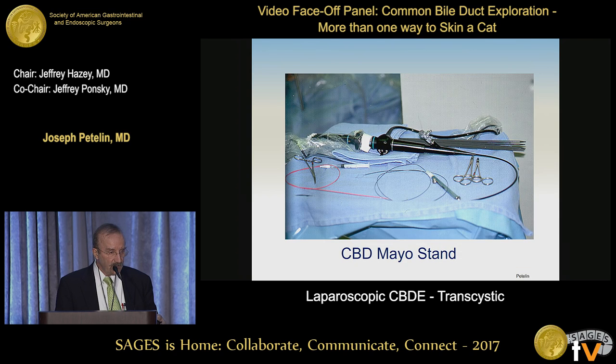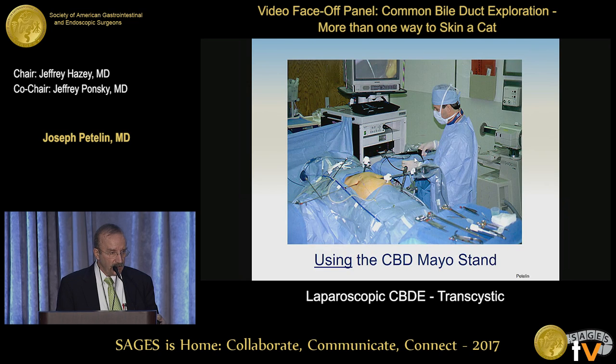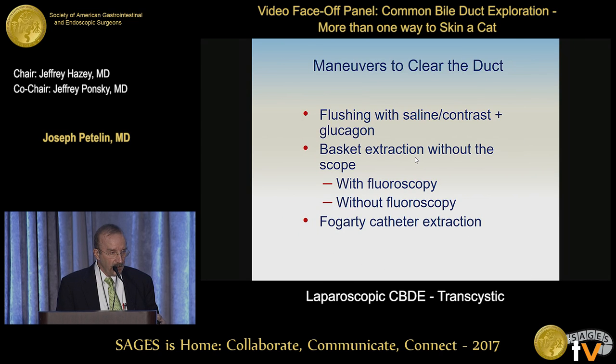And again, this is what you've seen on the video. Most of the time, we don't open all that stuff. We'll open the basket, and usually what I'll do is have Sherry open the basket before the scope is ever pulled, so we don't have to send it down for 24 hours again. And then that's sitting there, you've seen this.